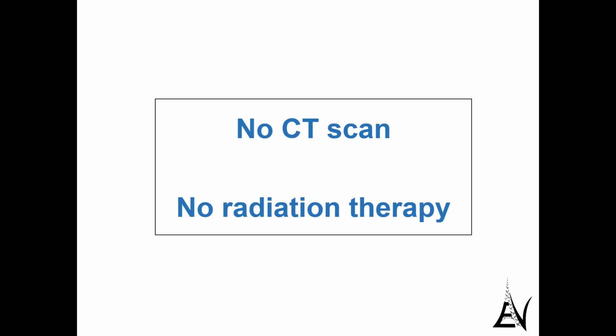You need a CT scan. I told you earlier that when I came back from Ohio State, I got trained in imaging, and the question was CT or MRI. It is still, that's another question. It's like maybe orthovoltage versus LINAC. I think CT scan will allow you to do very correctly 90% of your indications in imaging. And CT scan from a topographic point of view is absolutely excellent and necessary for radiation therapy. So we prefer in oncology at Eiffelvet to use CT scan first line.